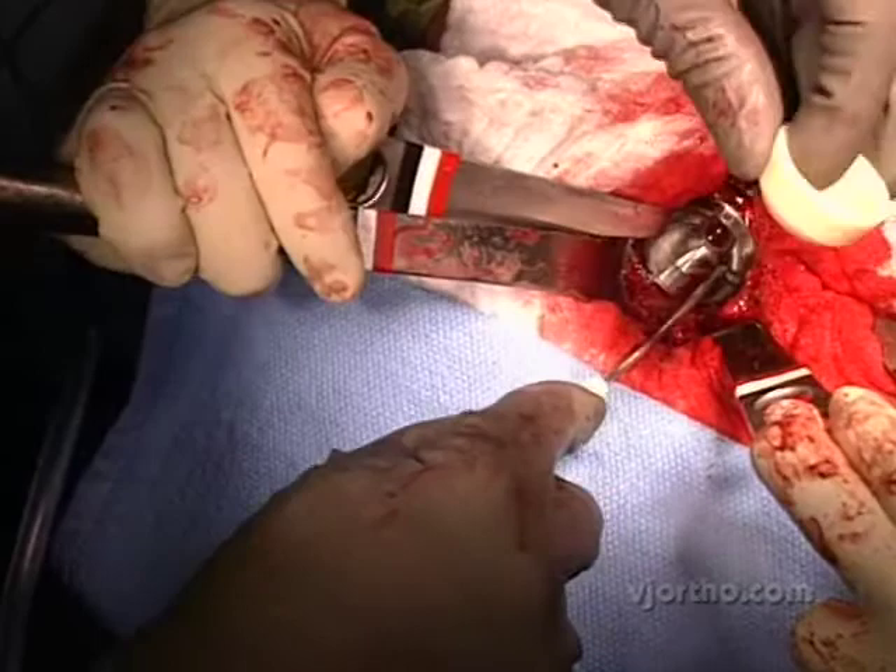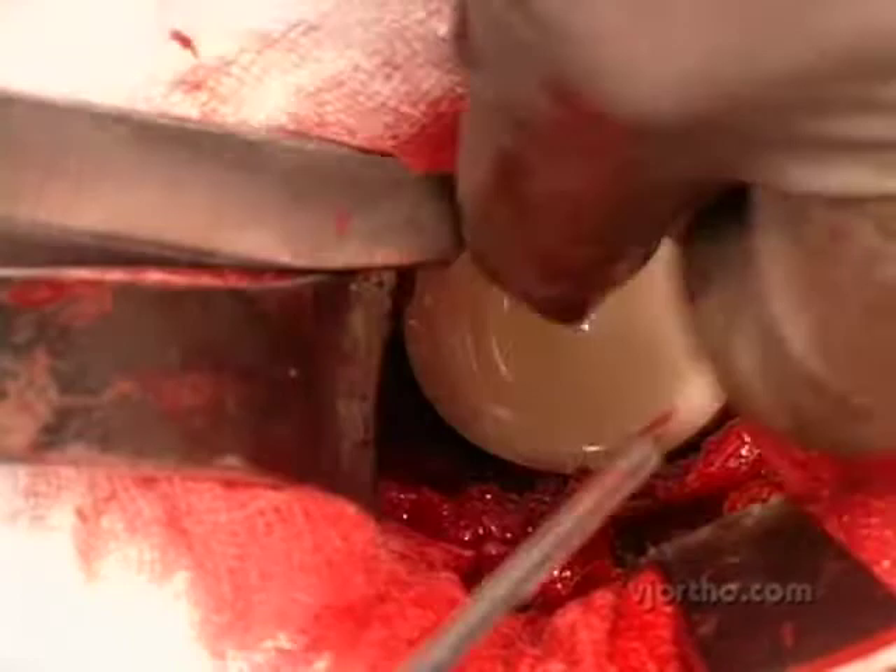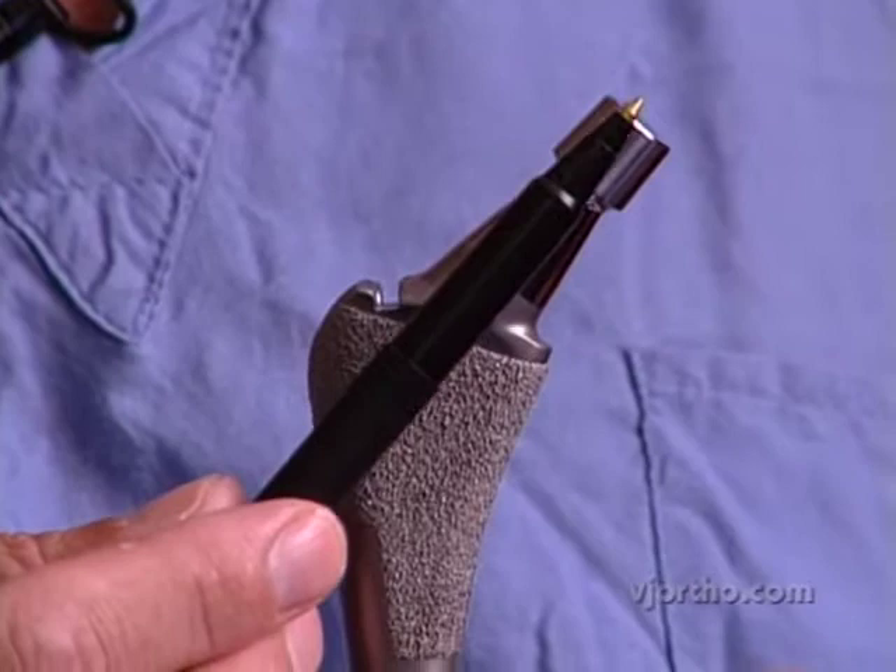It's extremely important to put the liner in by hand to make sure that it's fully seated. It's very simple to do by hand, and it's very important to fully seat it with your fingers before you hit it with an impactor.